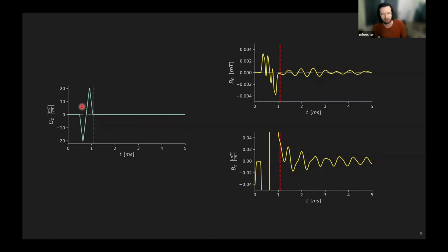It's going to change the flow encoding a little bit, but it's unlikely to be more than a couple percent or something. So that's not actually as big of a deal. What we care about is what's going on during the readout, because wherever the TE hits, whatever these eddy currents are, they're going to turn into that background phase.